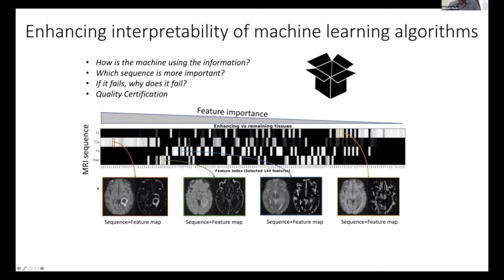And moreover, what's very interesting is here you can see the corresponding sequence, and you can see the feature map. In other words, these figures here are how the neural network looks at the sequence, and is the information that drives that task. You can see here that this part of the tumor is the most important, and it's highlighted to perform segmentation of the T1 contrast.